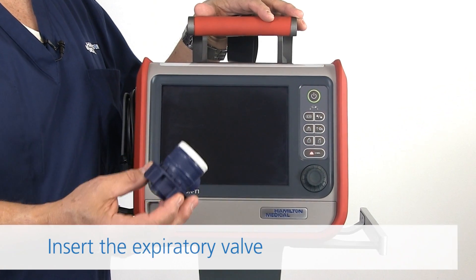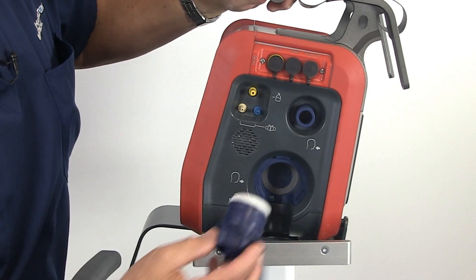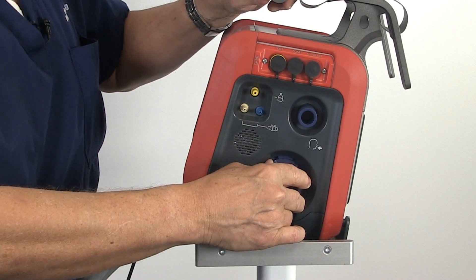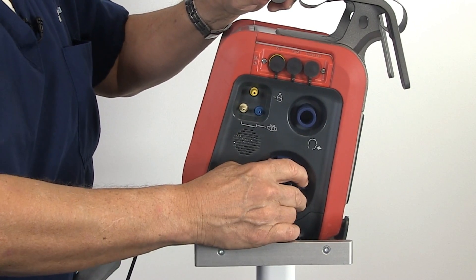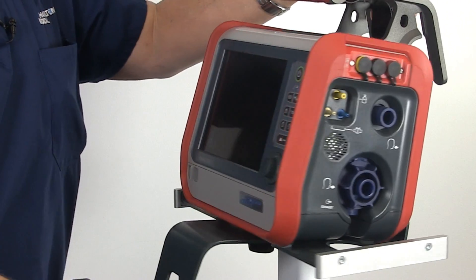Now we're going to talk about the exhalation valve and how to insert it. You turn your vent around to the port, put it in all the way. You take one quarter turn to the right and you'll hear a click and it's in. Always check to make sure it's tight. That's the exhalation valve.